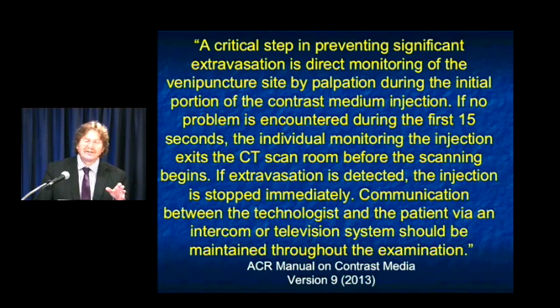And yes, contrast extravasation with non-ionic contrast is not the same as it was in the past with ionic contrast, which was a total disaster. But the problem with non-ionic, it's not painful. So if a patient extravasates, they don't tell you, oh my God, this hurts. With ionic contrast, with 1 cc, they would be screaming. Even if it didn't extravasate, they'd be screaming. But with things like Visipaque and Omnipaque, you don't have any pain.